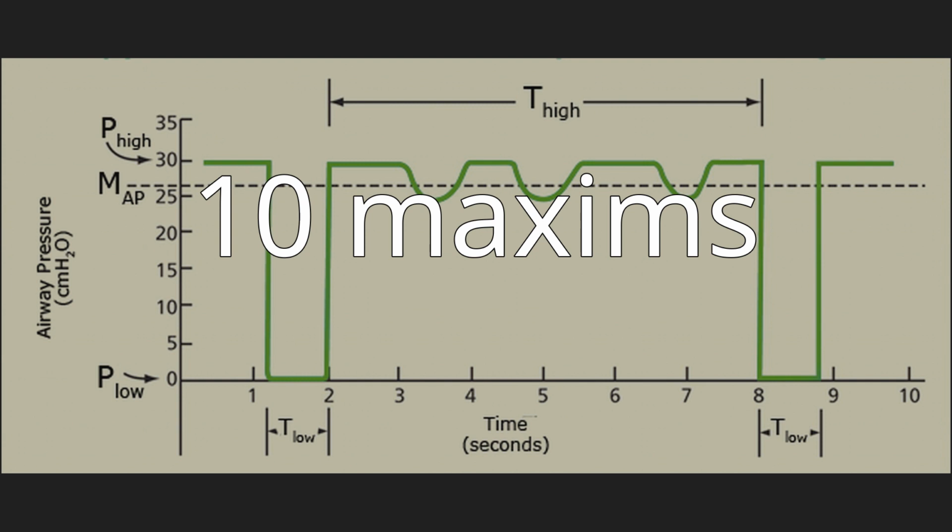Patient triggering means starting inspiration based on a patient signal independent of a machine trigger signal. Machine triggering means starting inspiratory flow based on a signal from the ventilator, independent of a patient trigger signal. Patient cycling means ending inspiratory time based on signals representing the patient-determined components of the equation of motion, i.e. elastance or resistance, and including effects due to inspiratory effort. Flow cycling is a form of patient cycling because the rate of flow decay to the cycle threshold is determined by patient mechanics. Machine cycling means ending inspiratory time independent of signals representing the patient-determined components of the equation of motion.